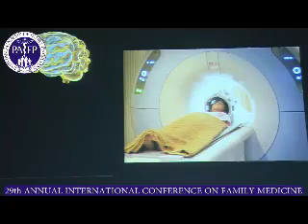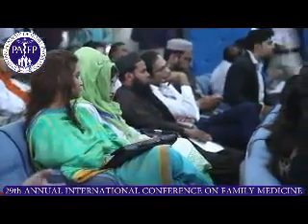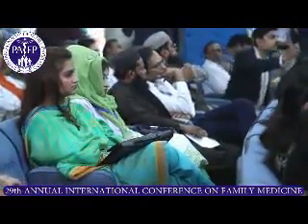If you have a bed or a metal which is not MR compatible, then the patient will feel the pull and push as he enters the MR room. You don't have to place the patient inside the MR. It's only when you enter the room you start getting that pull.